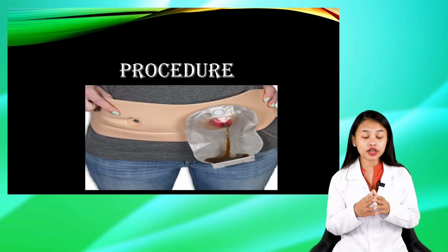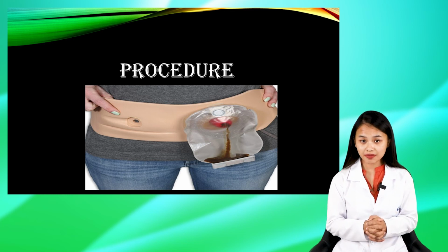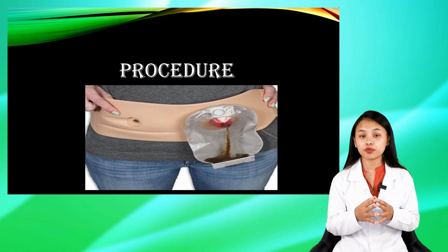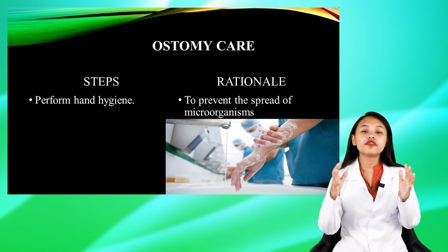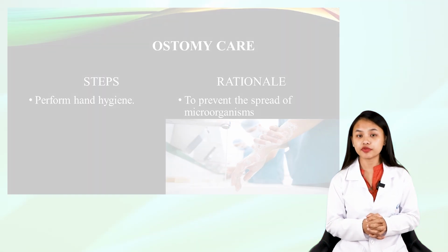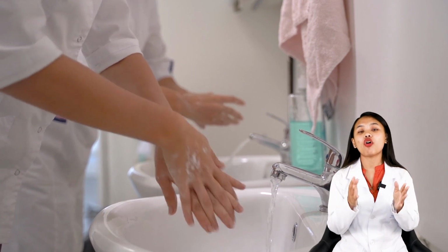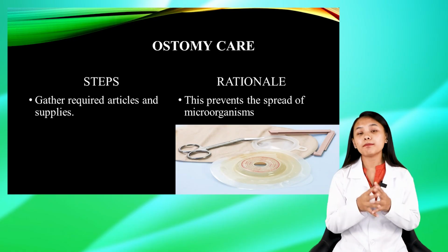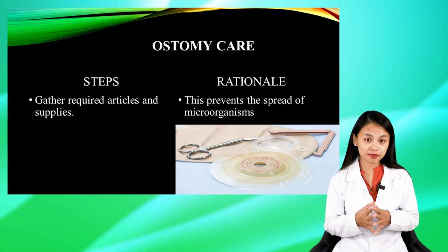Since we have learned what an ostomy is and what the different types are, now let us move on to the procedure. As always, before we perform any procedure, we must wash our hands in order to prevent cross-contamination. We must also gather all the equipment and supplies.